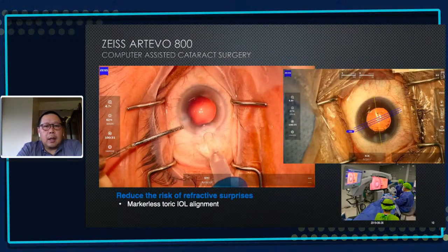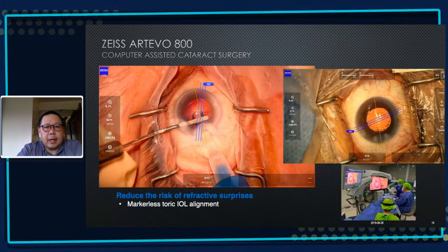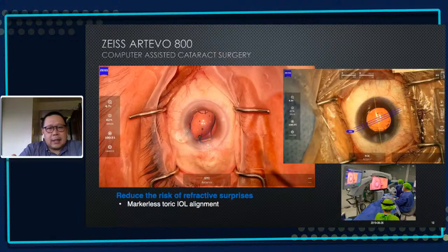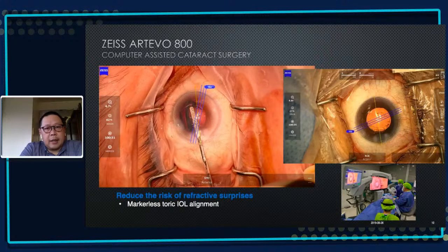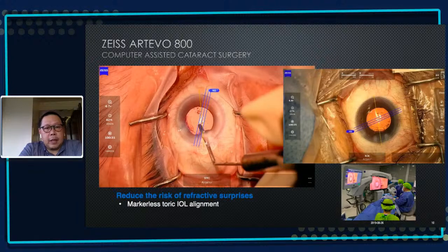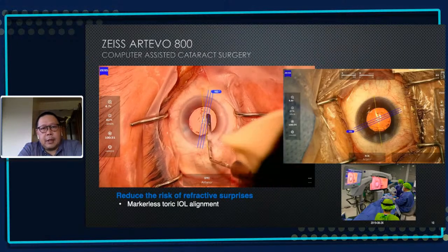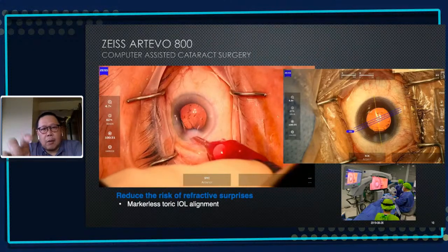Now, this is the part when I put the lens implant for the premium IOL. You see there, the lens kind of flipped a little bit. But I think this is, aside from seeing the toric markers there, an advantage of the plate haptic platform of the ZEISS intraocular lenses. It's soft enough that you can flip it safely. And you can actually move it clockwise, counterclockwise.